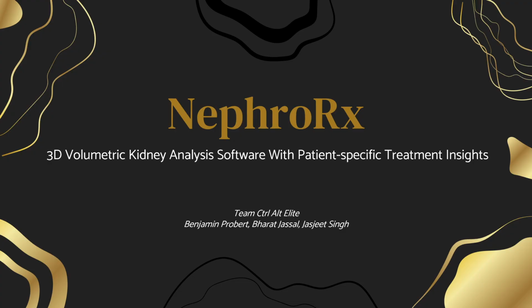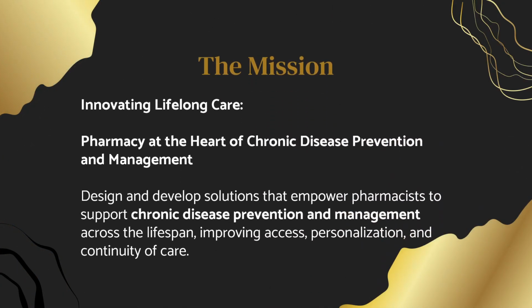We asked ourselves, what if we could make it visible earlier? Introducing NephroRx, a 3D volumetric kidney analysis software with patient-specific treatment insights. Before we talk about what NephroRx does, I briefly wanted to speak about how this idea came to us.